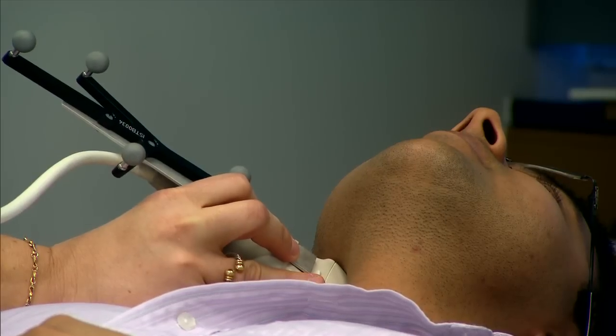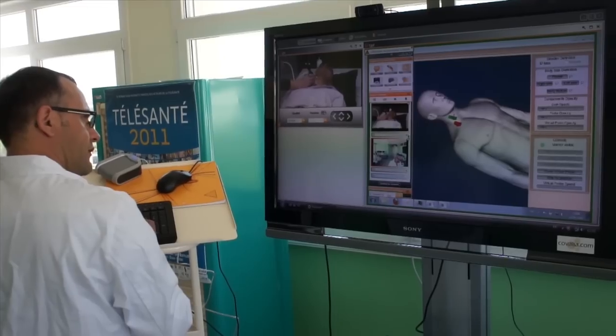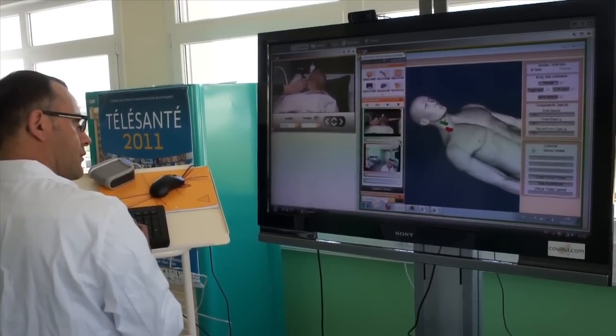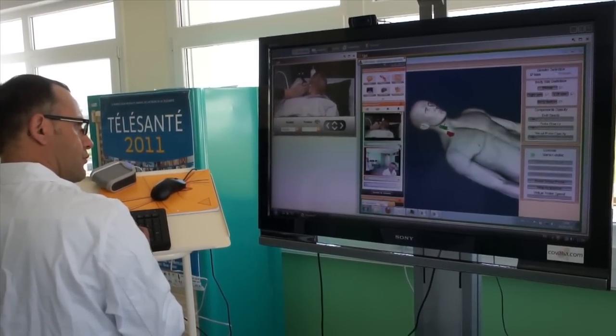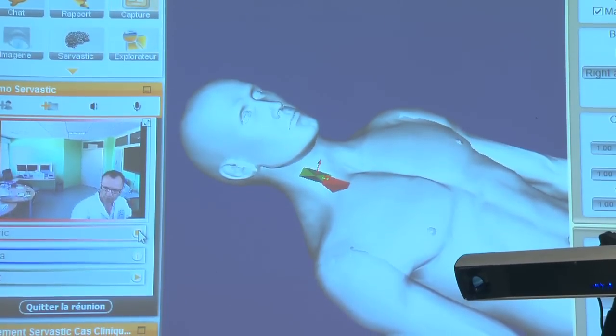What we have developed is that we have equipped a normal ultrasound probe with markers that are visible by a tracking system. The tracking system allows us to position this object in 3D with respect to the patient. This 3D position captured by the tracking system is then reported on the remote side on a 3D model of the patient, allowing the remote expert to really visualize the position of the probe.